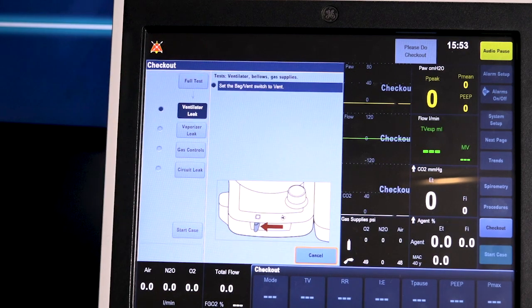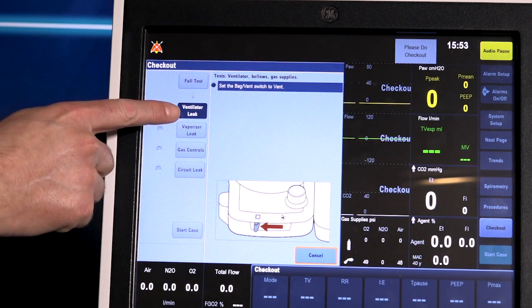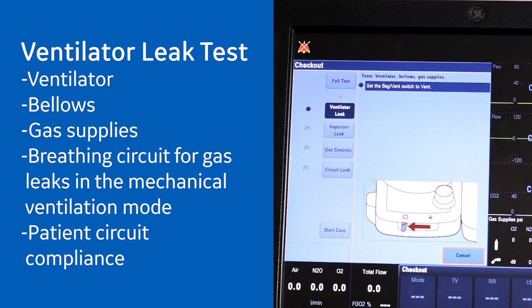The full test is broken up into four parts: ventilator leak, vaporizer leak, gas controls, and circuit leak. The ventilator leak test checks the ventilator, bellows, gas supplies, and breathing circuit for gas leaks in the mechanical ventilation mode. The patient circuit compliance is also measured.